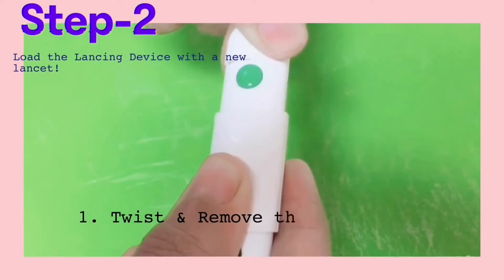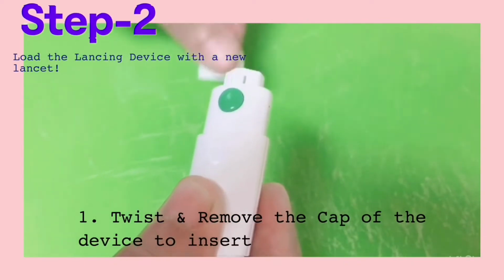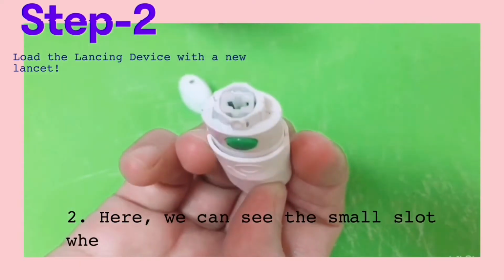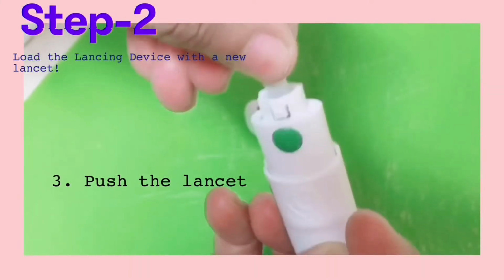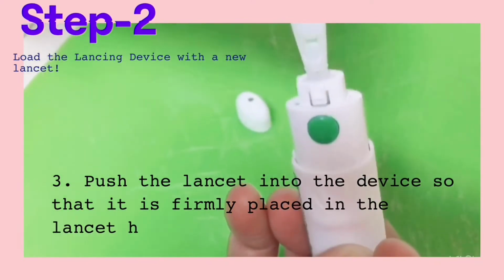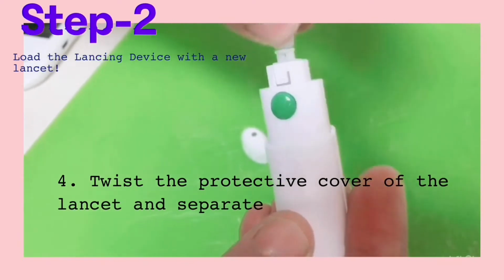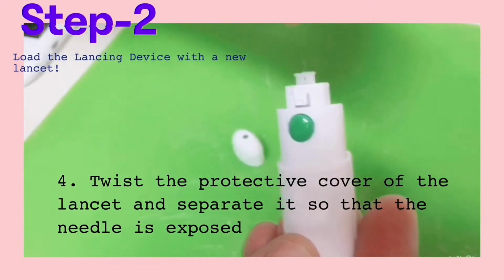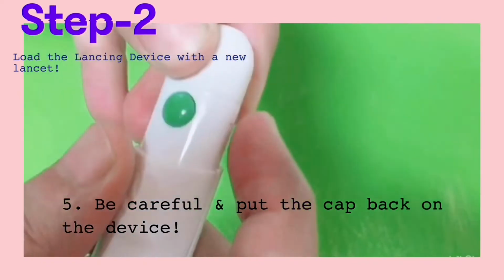Step 2. Load the lancing device with a new lancet. So for that, first, twist and remove the cap of the device to insert a new lancet. So here we can see the small slot where lancet needs to be fixed. Then push the lancet into the device so that it is firmly placed in the lancet holder. So now twist the protective cover of the lancet and separate it so that the needle is exposed and we can see. Be careful and put the cap back on the device.